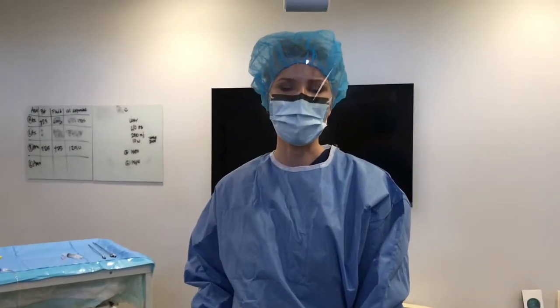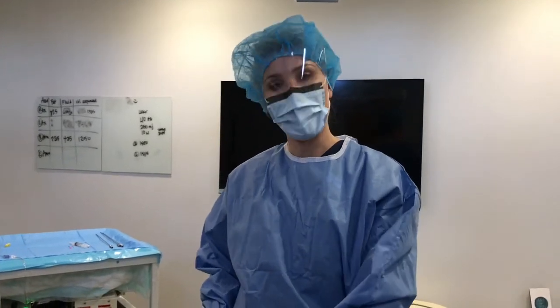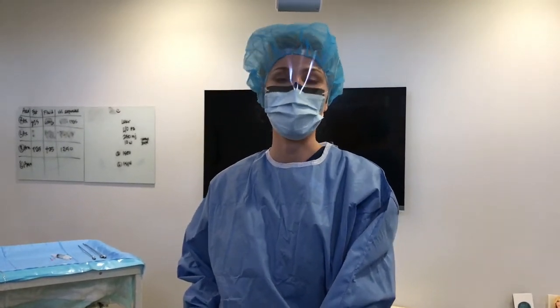Hi, I'm Dr. Melanie Palm from Artiskin MD in San Diego, California, and today we're doing arm liposuction. On my previous video, I showed doing liposuction or liposculpture in the area underneath the arm, which is sometimes referred to as the bat wing or axillary arm fat.